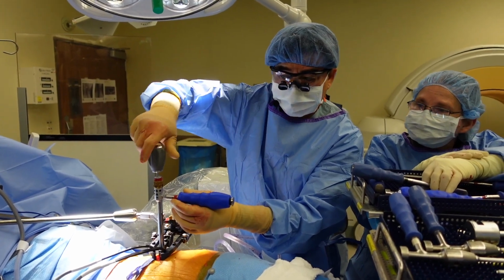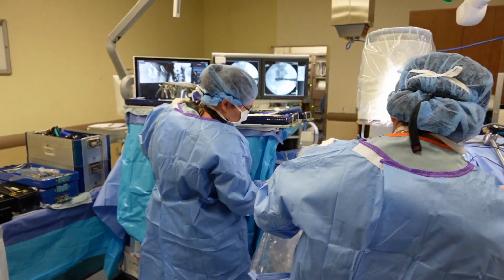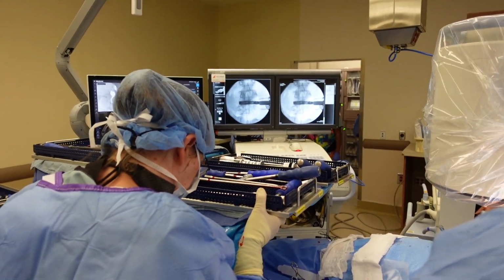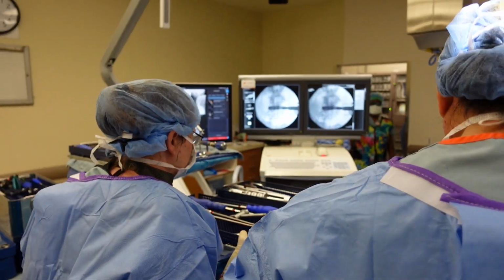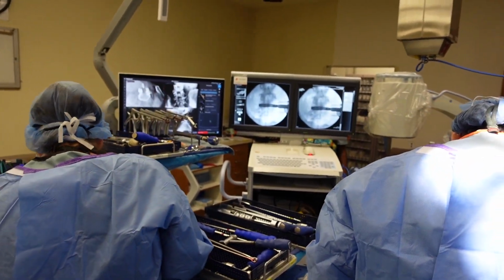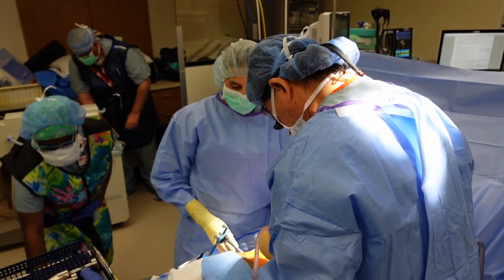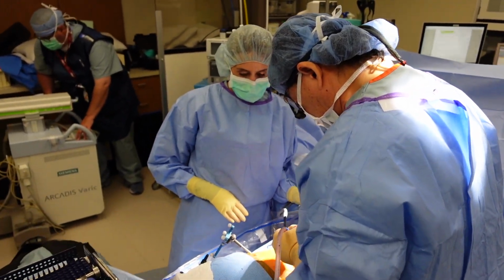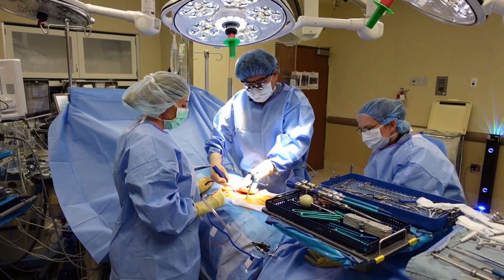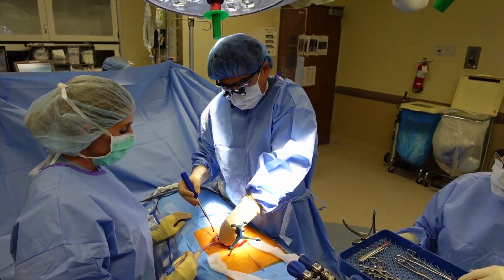I have tons of tactile feel here. Head back down. So far so great. Got a really nice expandable spacer in here. Really good fit. No bleeding. Minimal incision size. I like it. Alrighty, the front side went really well. Now I'm doing the back part to lock everything down.